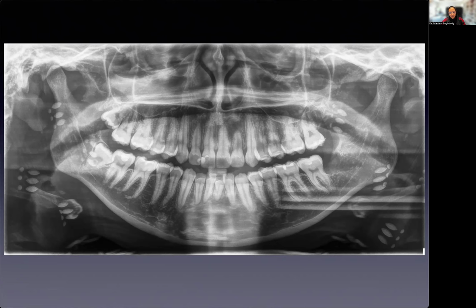But make sure when you're looking at your patients to make sure they don't have anything like that. Now, recently, we've been asking all of our patients with hijab to take off their hijab to make sure that they don't have any pins or anything in their hair, and at the same time to make sure that their hijab doesn't have anything on it that will cause artifact. Okay.